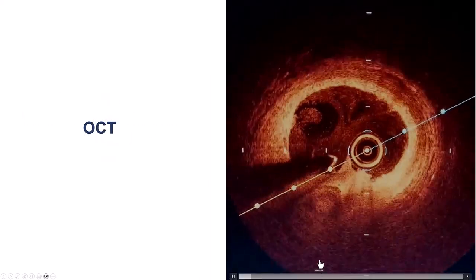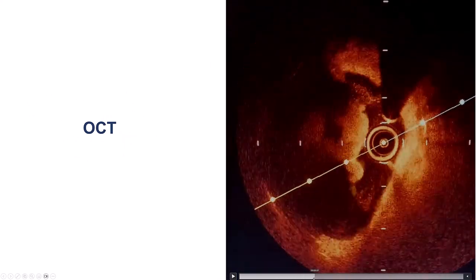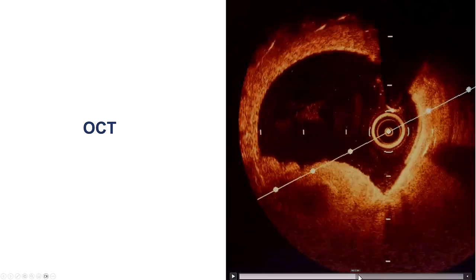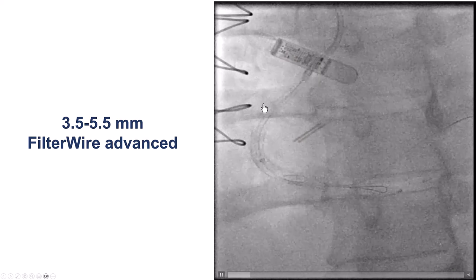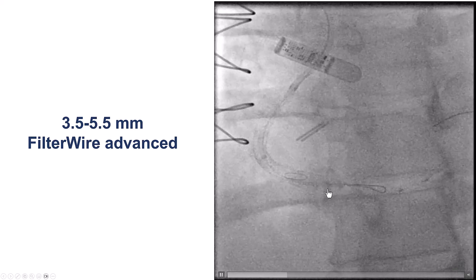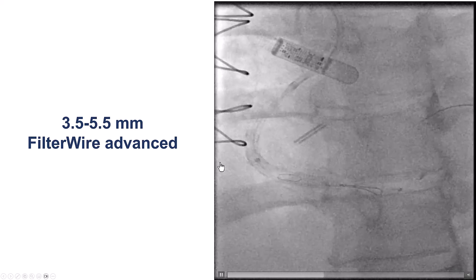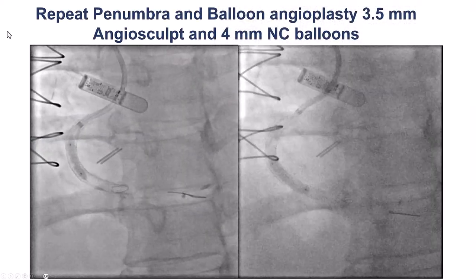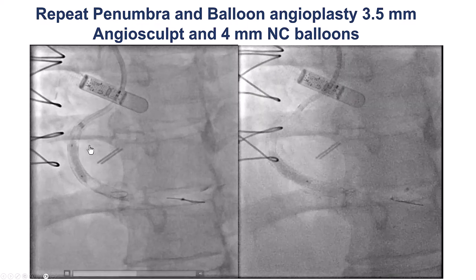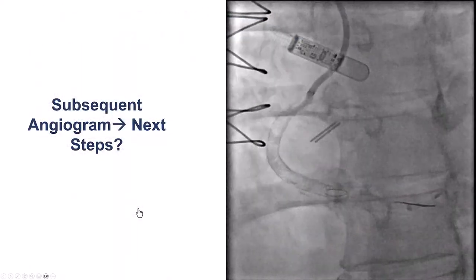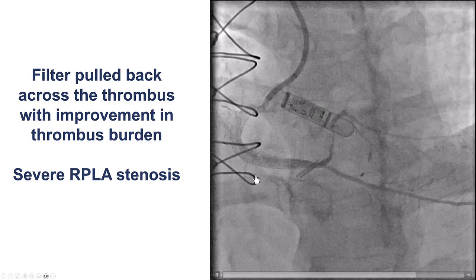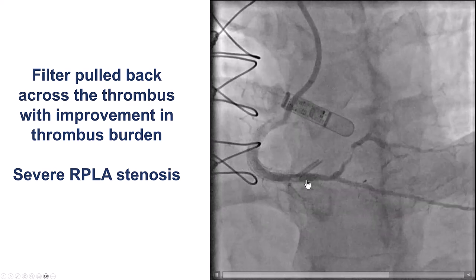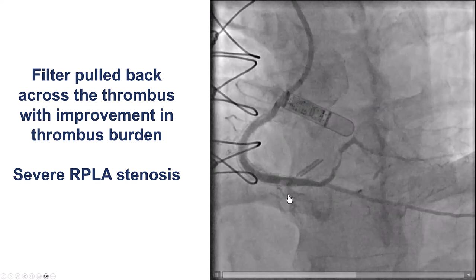Once again we performed optical coherence tomography, revealing large thrombus burden inside the RCA in multiple locations. Another approach was to advance a filter wire distal to the thrombus and try to retrieve it. We did multiple aspirations with the Penumbra device and balloon angioplasty, using the filter as a potential capture mechanism. The next injection showed a little improvement, but still a large filling defect. We pulled the filter back trying to scoop out thrombus, with some improvement but still a filling defect present.